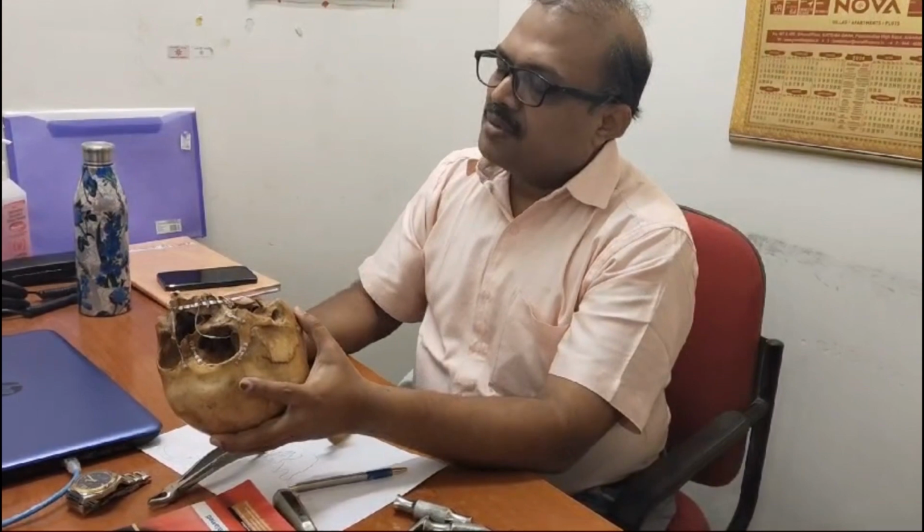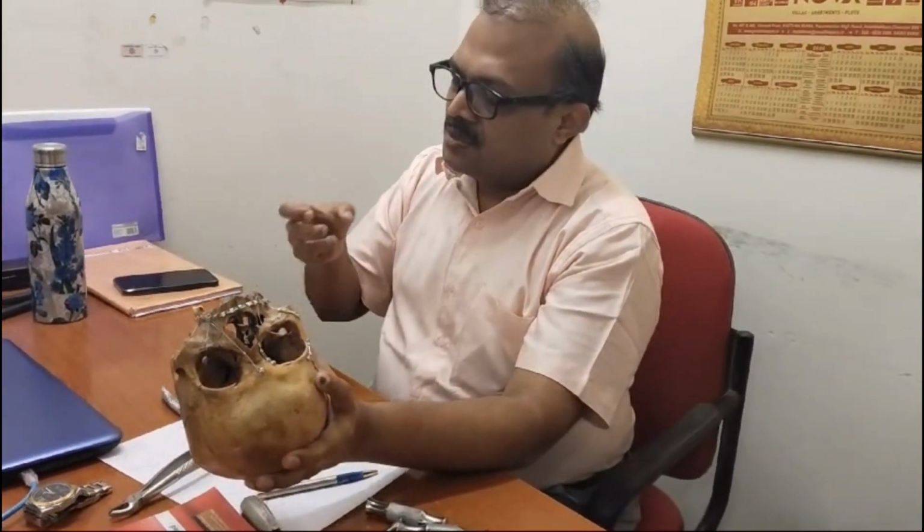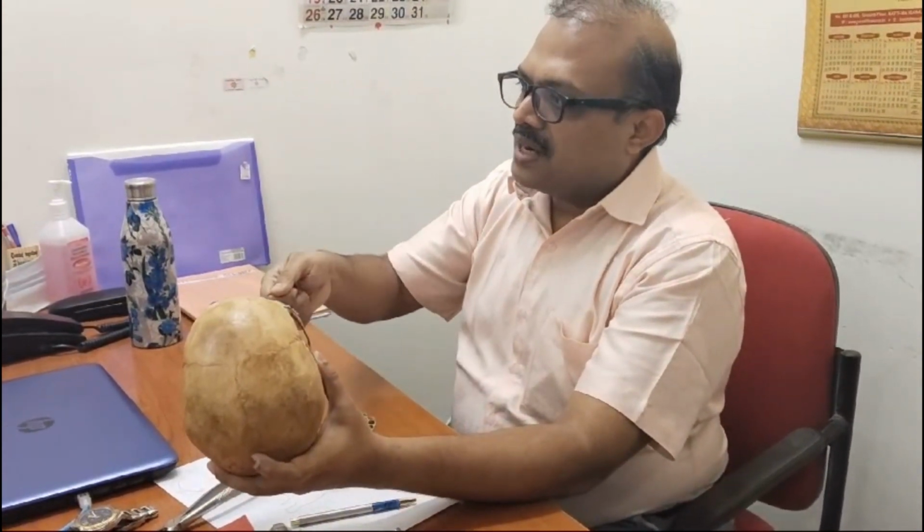So always remember, when you are doing an extraction, try to give maximum time for luxation of the tooth. Luxate the tooth well, then you give the tractional force. So spend time so that the bone will expand. Some physiological changes will happen which will make the procedure of removing the tooth easier. So you give a buccal force in the maxilla. Similarly, in the anterior, you give a labial and palatal force and try to remove in the labial direction with slight rotation.